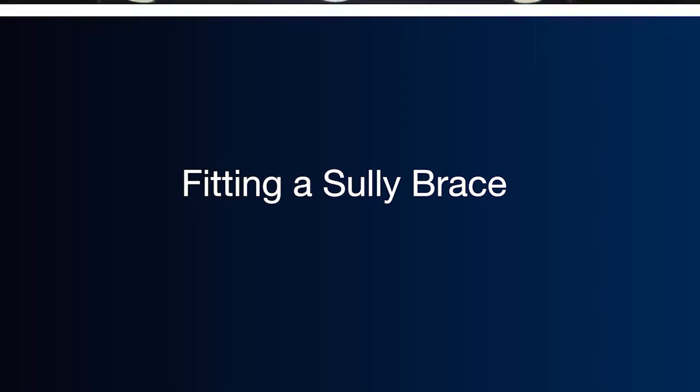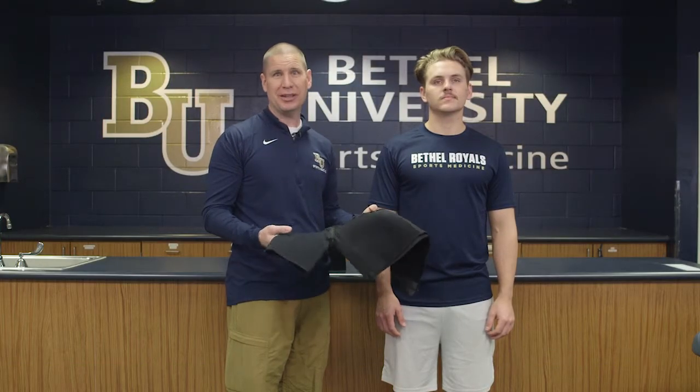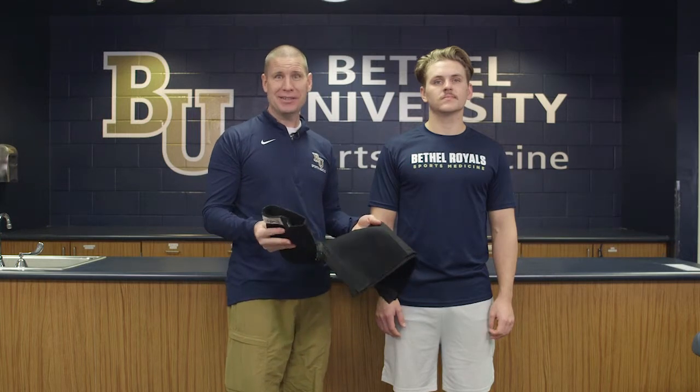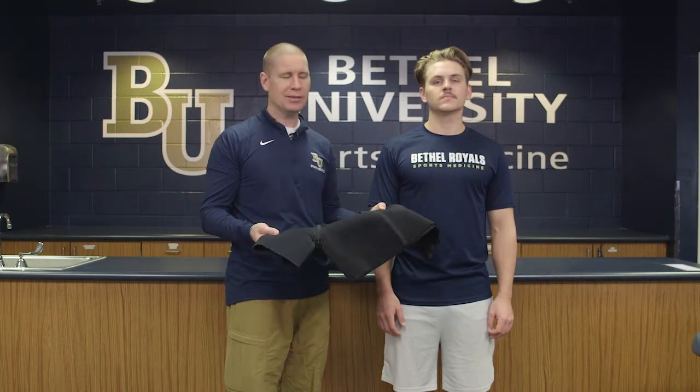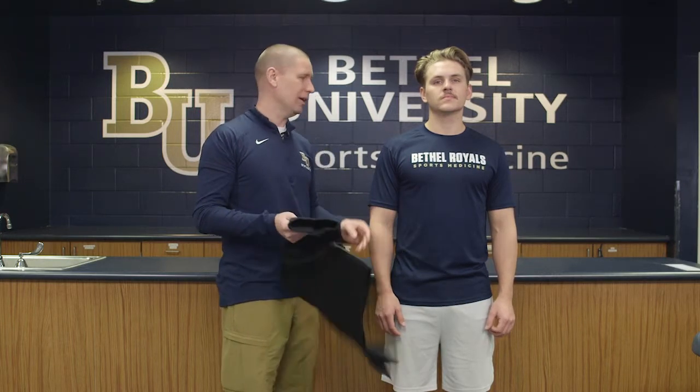This video is to instruct you on how to apply the Sully brace. The Sully is the name of the brace itself — it's made by Saunders, and it's one of the most beneficial and useful braces for treating somebody with any type of shoulder instability.